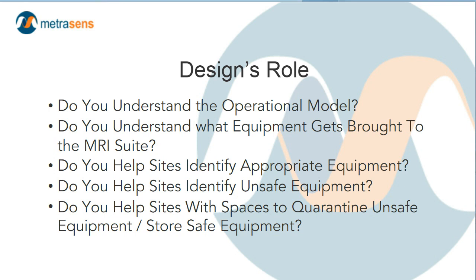Can we identify things that might live inside the MRI suite that we know are unsafe? Are those things that we can exclude or remove from the controlled access portions of the suite? Or can we do something to make them more conspicuous, to make it more obvious that this object or device really shouldn't continue towards the MRI room?